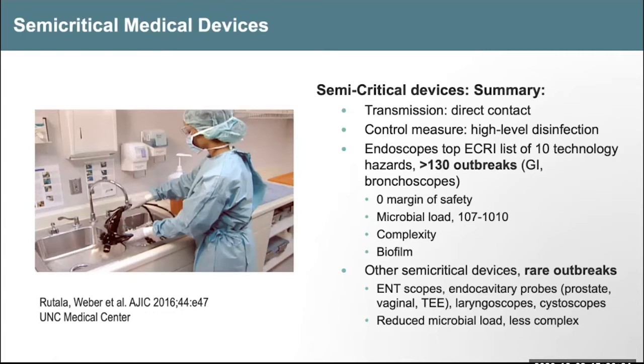This, of course, is many more organisms than we find on surgical instruments. They're complex biofilms, and we'll talk more about that. For other semi-critical devices, laryngoscopes, endocavity probes, cystoscopes, they're much less complex. They have a reduced microbial load, and outbreaks have been very uncommon.